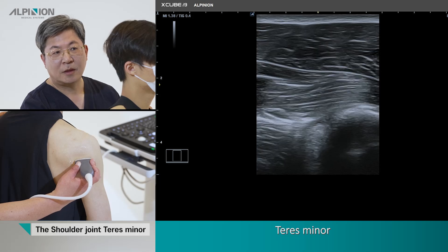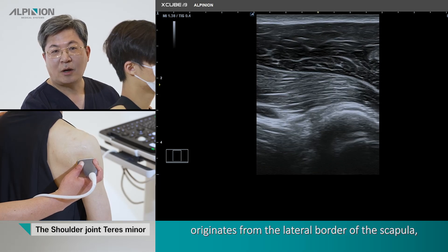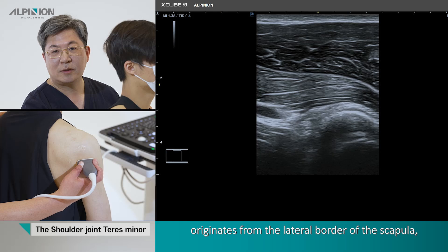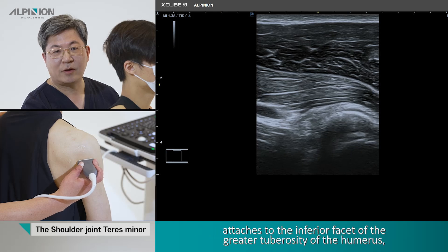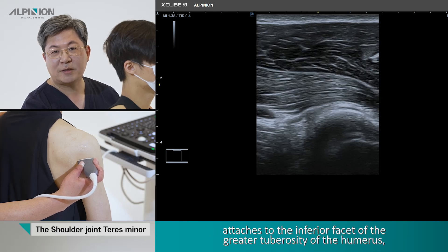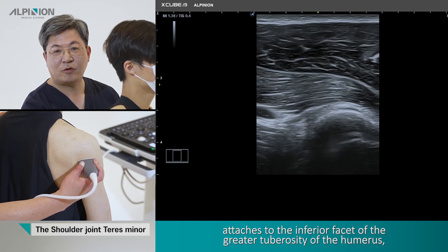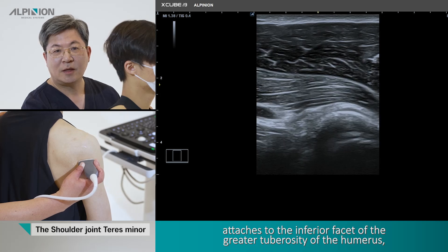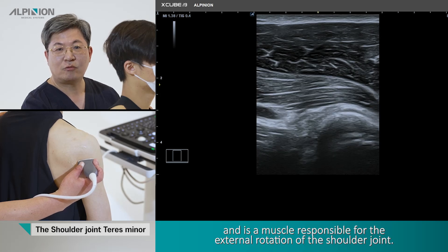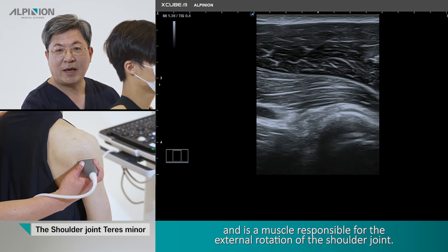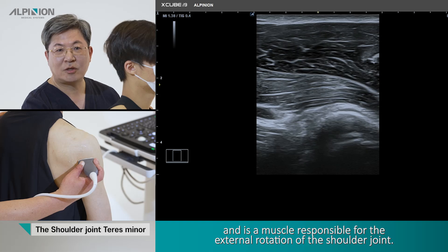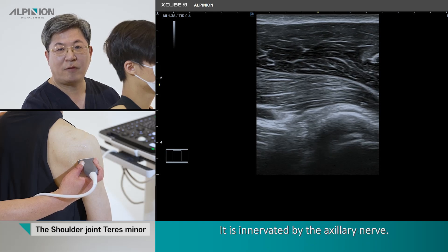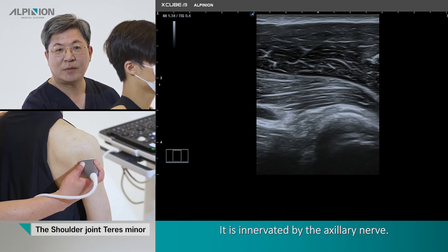The teres minor originates from the lateral border of the scapula and attaches to the inferior facet of the greater tuberosity of the humerus. It is the muscle responsible for the external rotation of the shoulder joint, and it is innervated by the axillary nerve.